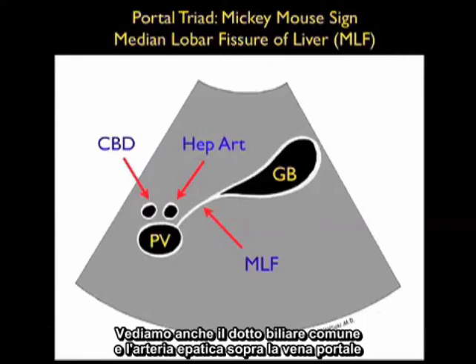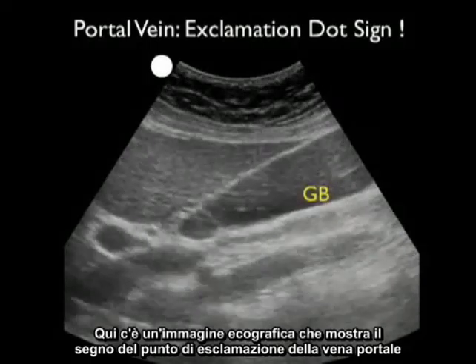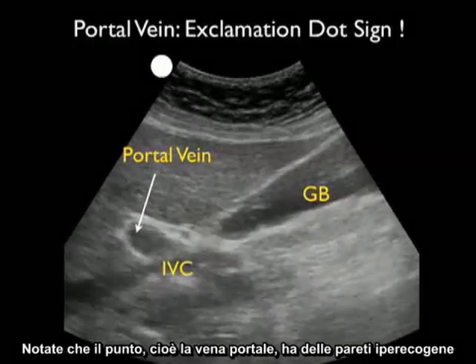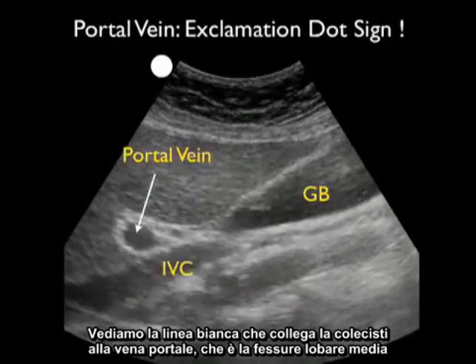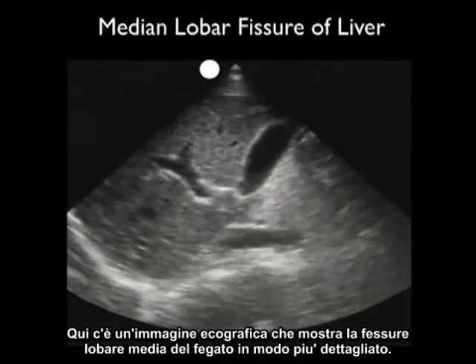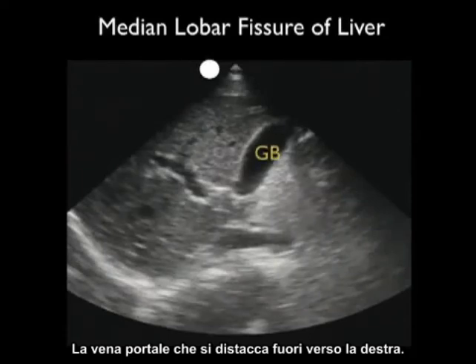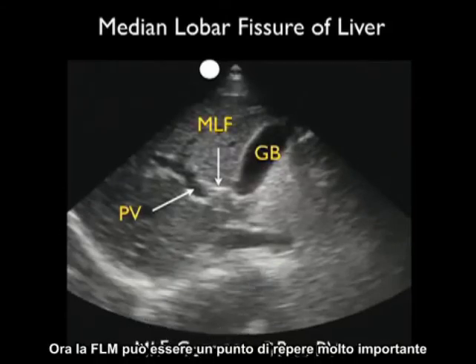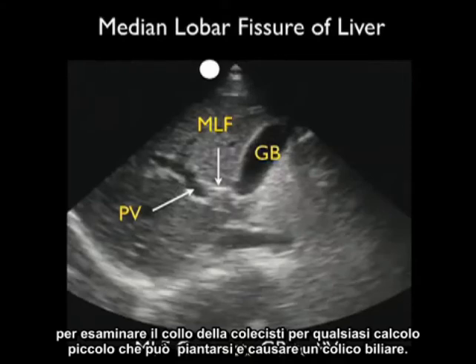We also see the common bile duct and hepatic artery on top of the portal vein, making up the structures of the portal triad. Here's an ultrasound image showing the portal vein exclamation dot sign — the gallbladder to the right makes the exclamation and the portal vein to the left makes the dot. Notice the portal vein has hyperechoic walls due to bringing fatty blood from the intestine to be filtered by the liver. We see the white line connecting the gallbladder to the portal vein — the median lobar fissure — and posteriorly the inferior vena cava. The MLF is a very important landmark for walking your way up to the neck of the gallbladder to inspect for small stones that may be lodged there causing biliary colic.